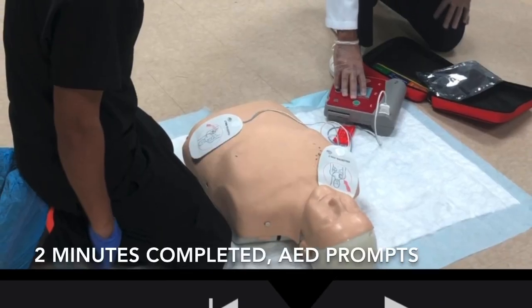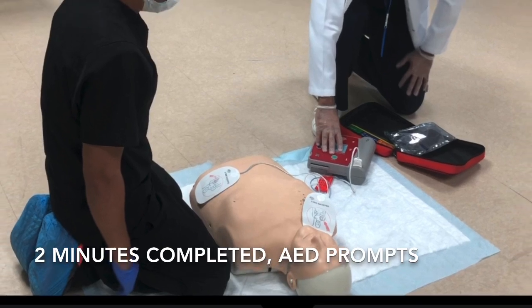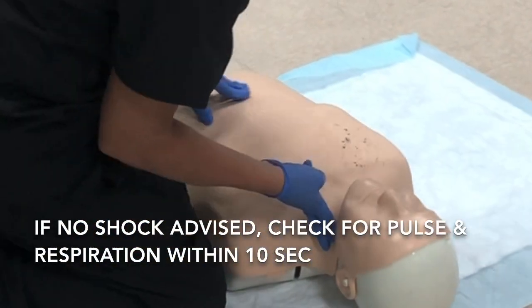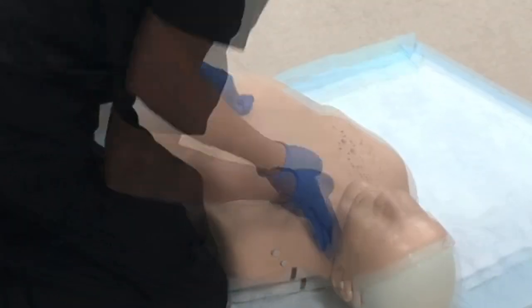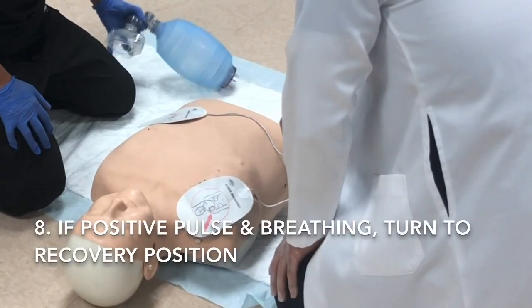Stay clear of patient. Analyzing heart rhythm. No shock advised. Checking for pulse and respiration — positive pulse, positive breathing. Turn the patient to recovery position.